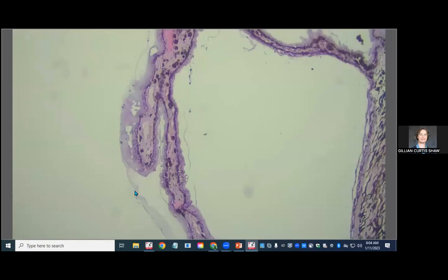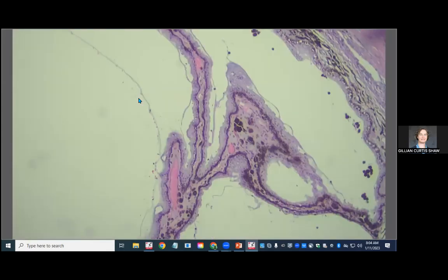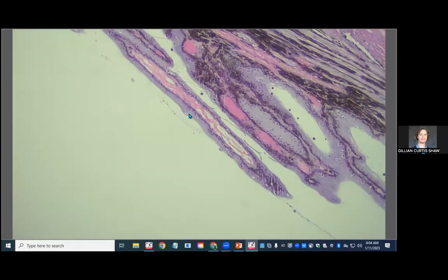So places like here it's sort of floating out in space, quite wispy. Here it's much denser, thicker, and then it blends with the ciliary body epithelium and it makes it difficult to determine where the epithelium starts and this material ends. It's multifocal. It doesn't affect the entire ciliary body. There's places like this where it's really hard to tell where the epithelium ends and that material begins. But then there's places like this where clearly the epithelium is unaffected.